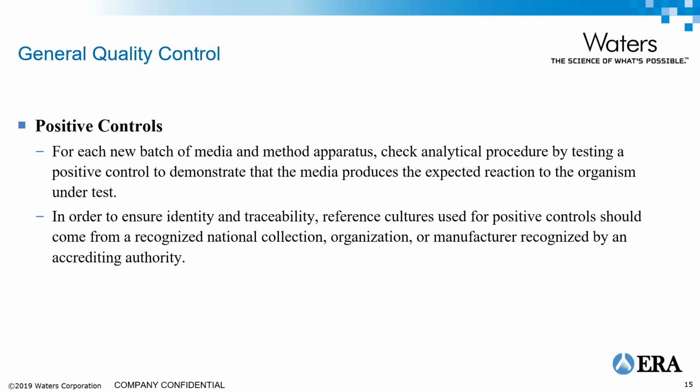You can purchase reference materials from recognized collections. There's lots of companies that produce traceable organisms that are traceable back to the original national collection. Or you can get them from a manufacturer that's actually accredited to some of these standards. So like our QC samples would work fine for this purpose.